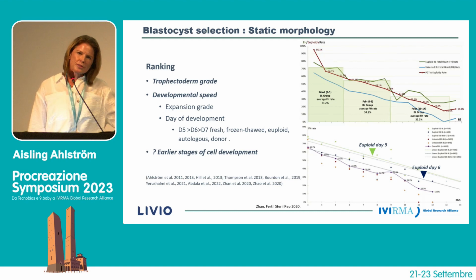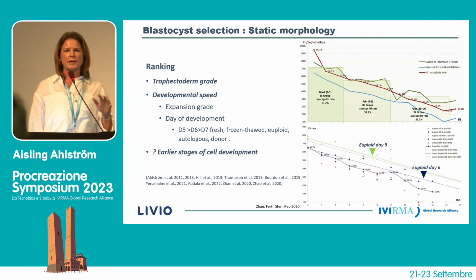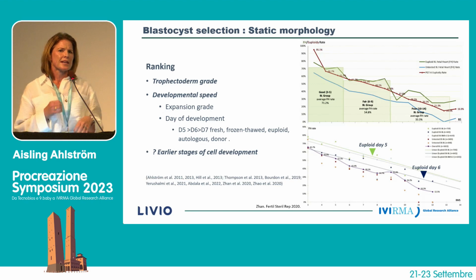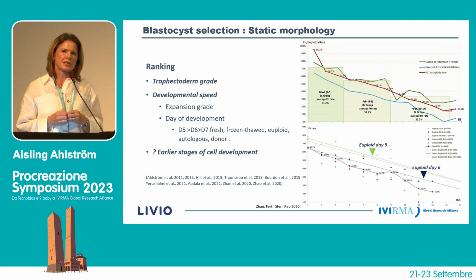Is there anything important in the stages leading up to the blastocyst stage? I think we've debated this for quite a long time, as long as I've been an embryologist, for over two decades, and there really is no consensus. In fact, I only think it becomes very important when you have two identical blastocysts and want to look back, reflect, and perform static observations earlier.